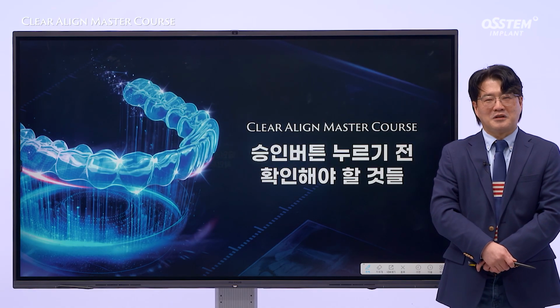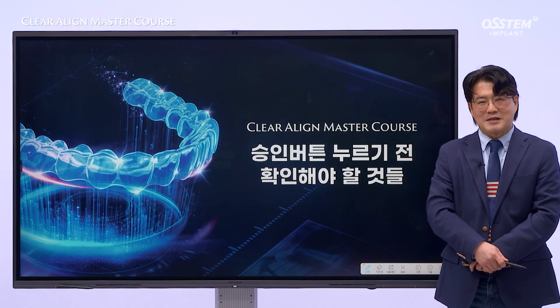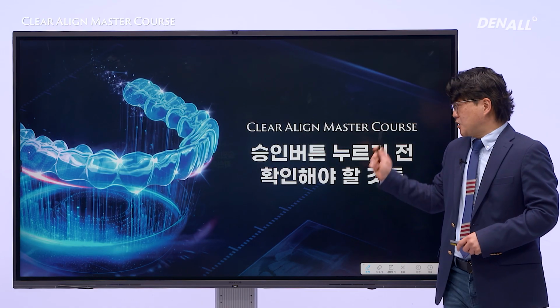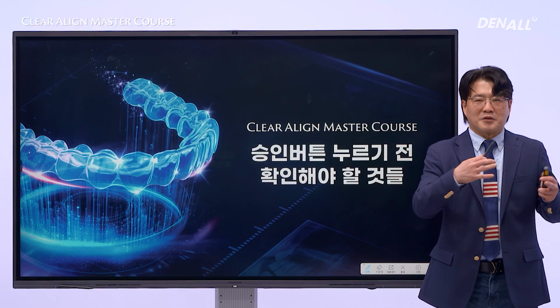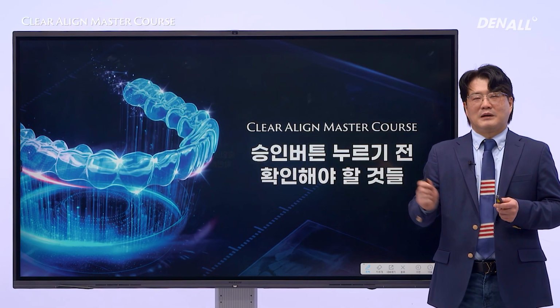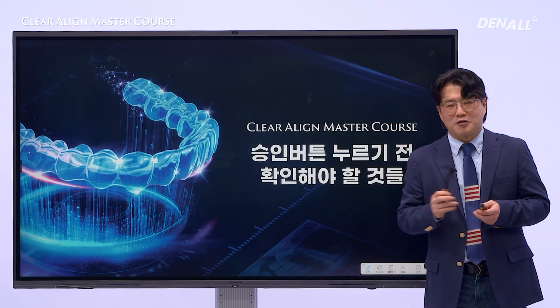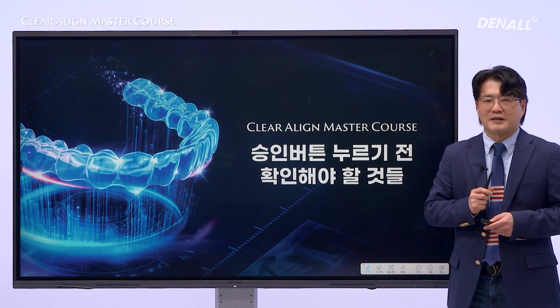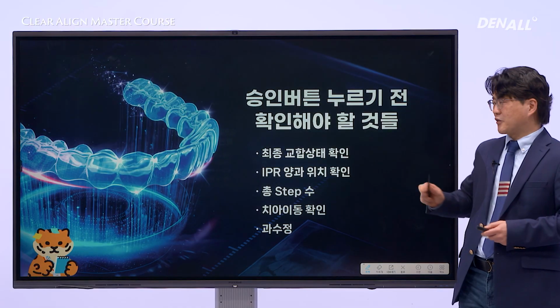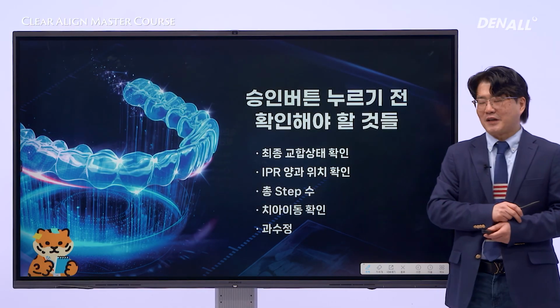Today marks our 7th session of the Clear Aligner Master course. Today, I'd like to talk about what you need to check before pressing the approve button. Once we send out the patient's records, we receive various treatment plans and viewers in return. At that point, it's time for us to hit the approve button. Before we do that, there are a few key things we need to check carefully.